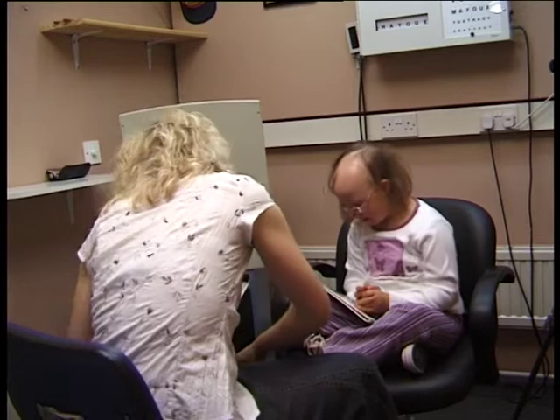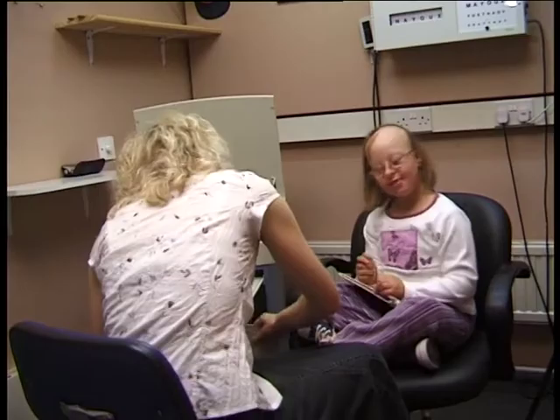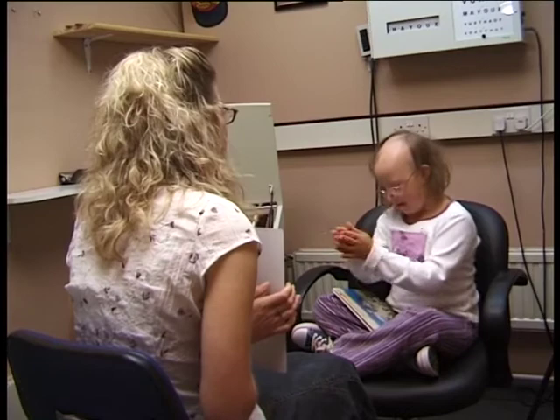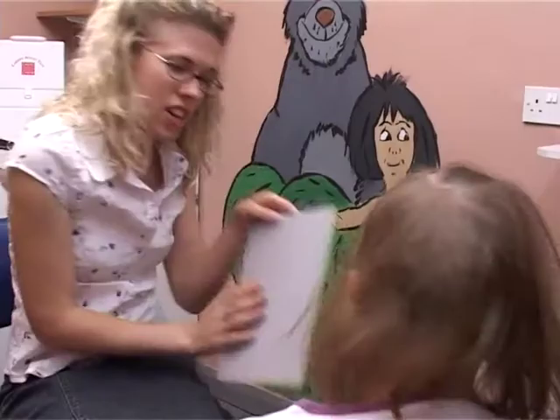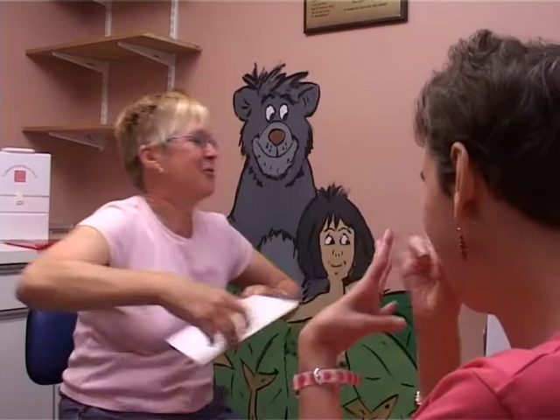There aren't many contrast sensitivity tests available, so we can use the Cardiff University contrast test over a wide age range and in lots of different ways. Victoria is naming the pictures for Helen and also using Makaton signs to tell us what the picture is. Joanne is deaf and uses sign language, so she can tell us what the pictures are by signing them rather than speaking. Because Joanne is an adult, we turn to the adult Cardiff contrast test and use more appropriate pictures.